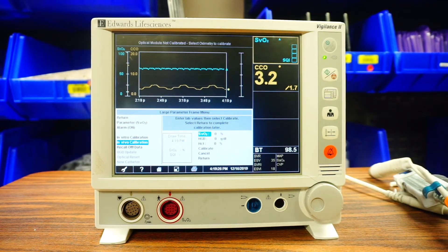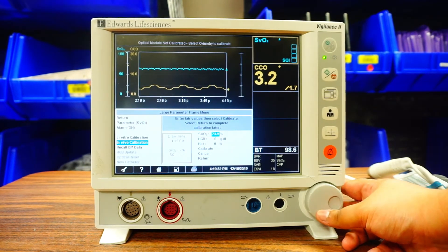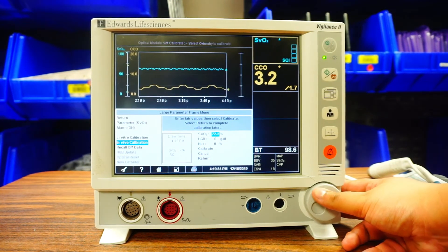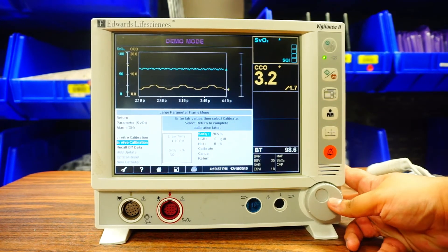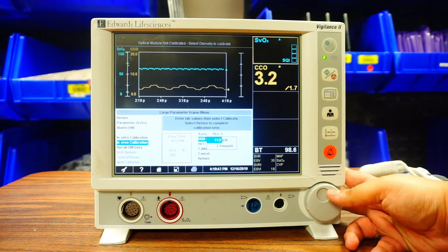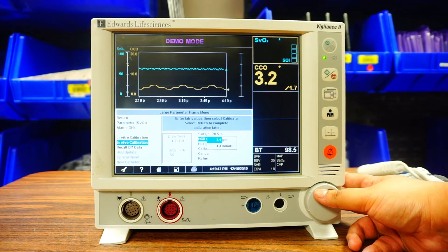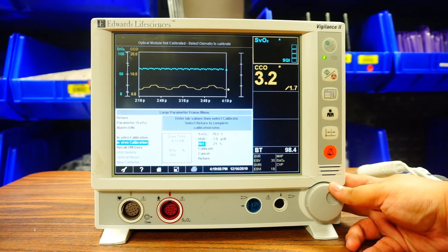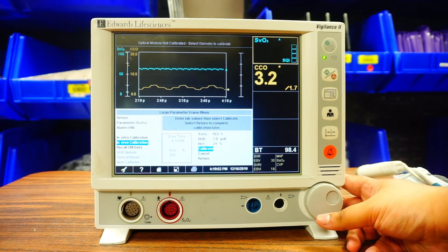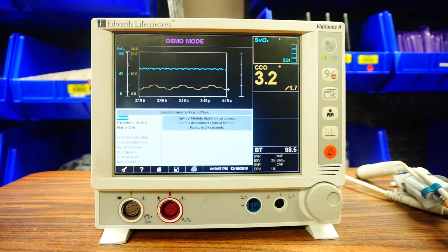Once you get your results, enter them in. For example, SVO2 was 70.5. Then put in your hemoglobin — we'll say it was 7. Hematocrit is automatically going to pop up. Once those three values are entered, press Calibrate. It's going to take 25 seconds to get that value, and then you will continuously see your SVO2 displayed.